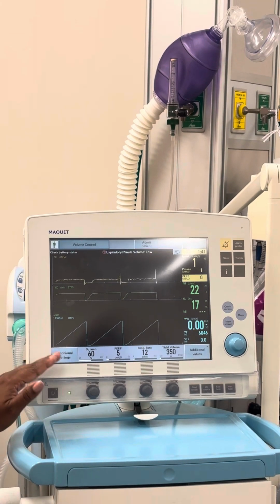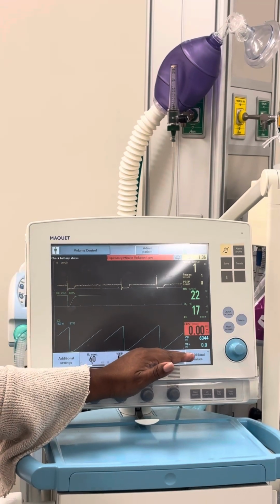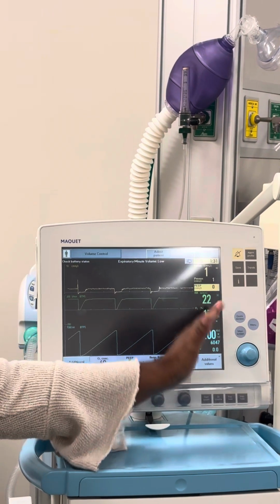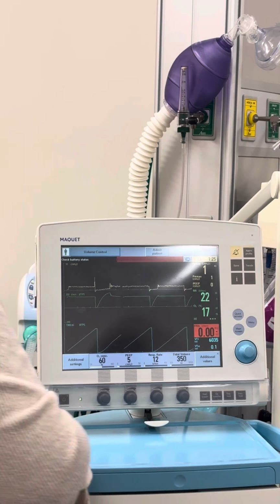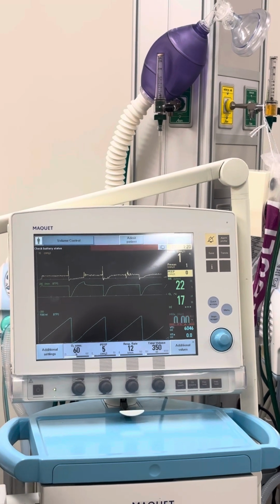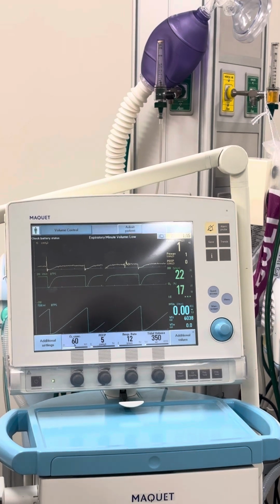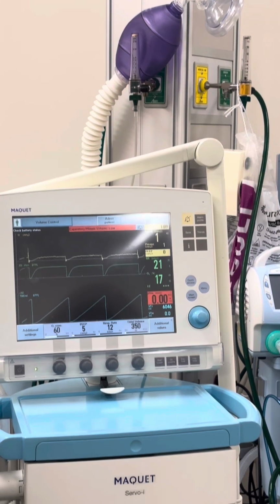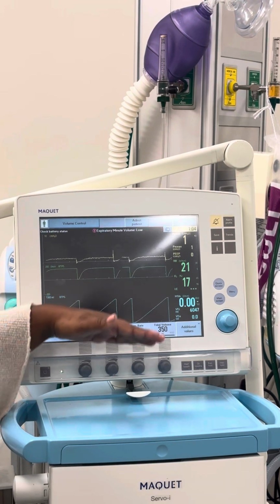All right. So your settings are here on the bottom, just like your settings over there on the bottom. But now where are your monitoring numbers? They're actually on the side, on the right side over here. There are no apneic settings on here as well. This machine has them defaulted in. So you're going to tell me on this ventilator that you would adjust your apneic settings, because remember that's part of your checkoff, and you would match it up with your initial settings. I would then adjust my apnea settings to match up everything with my initial settings.